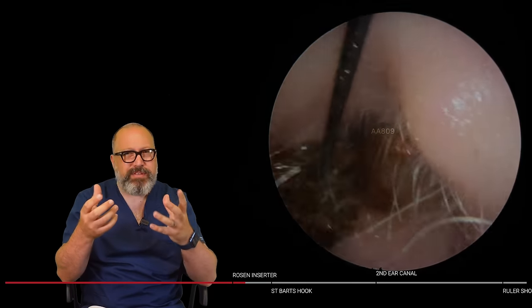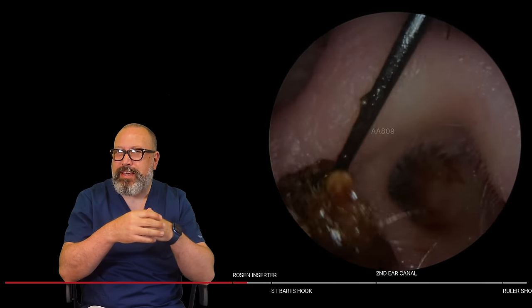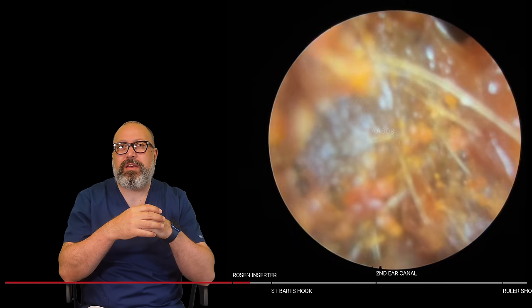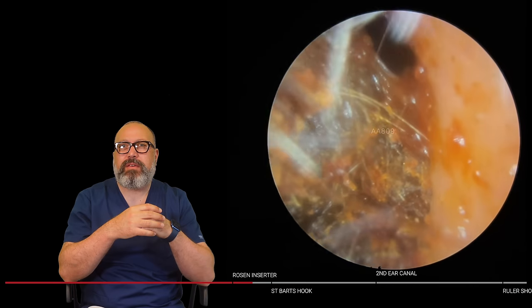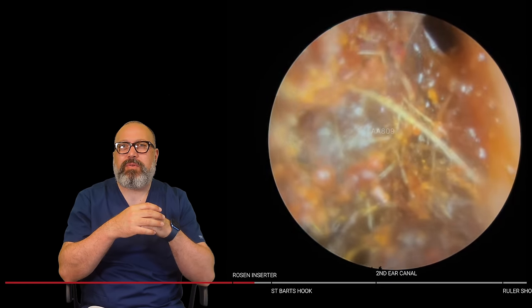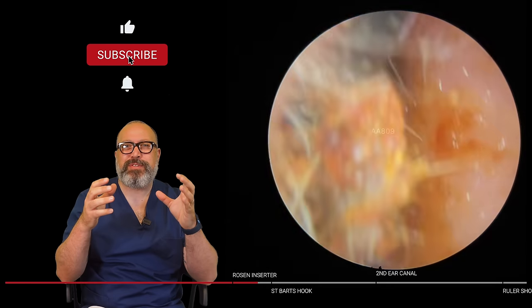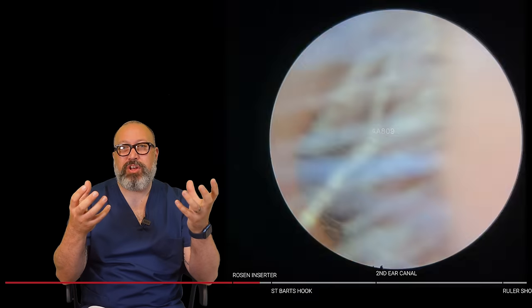Lots of little tiny bits of hair embedded in there as well, which is not helping, because it's holding everything together. It's fighting it, doesn't want to get picked up by the rosen inserter. There we go. Now we're going to try and go into that little gap just at the top there, I think. There we go. That's not working the way I want it to. I'd like it a little more solid at this point for the rosen inserter, because as you can see, it is breaking bits off, but it's breaking these chunks away.